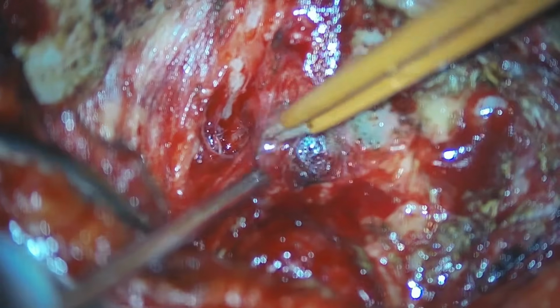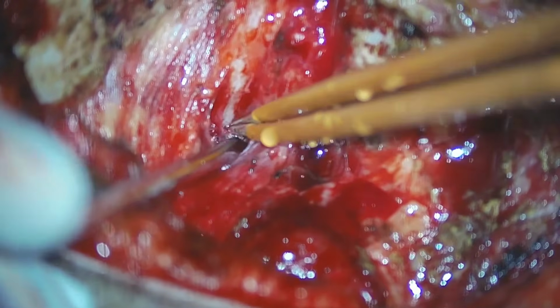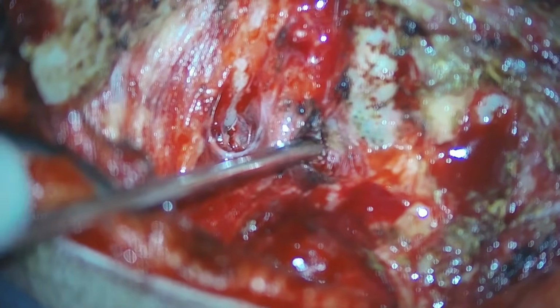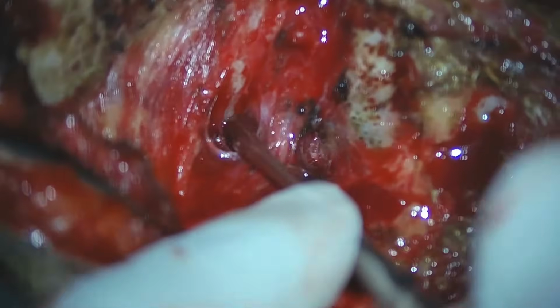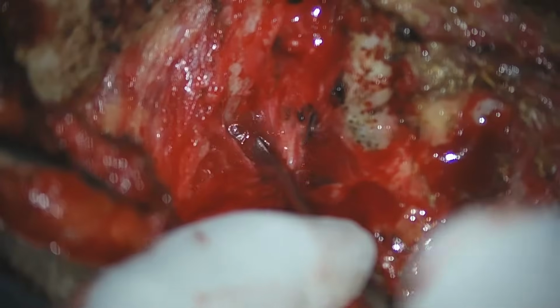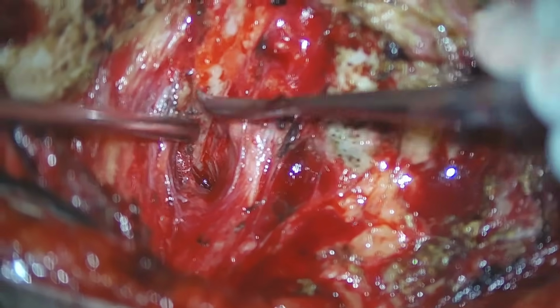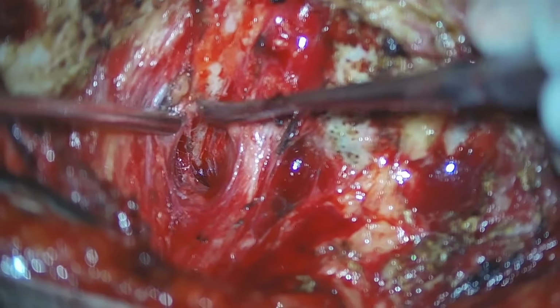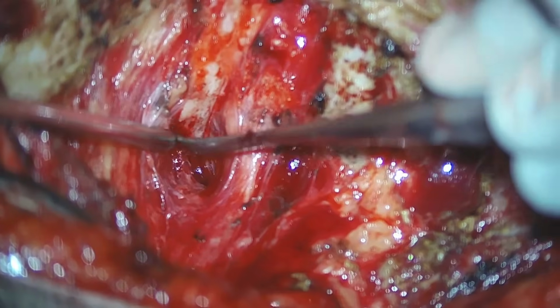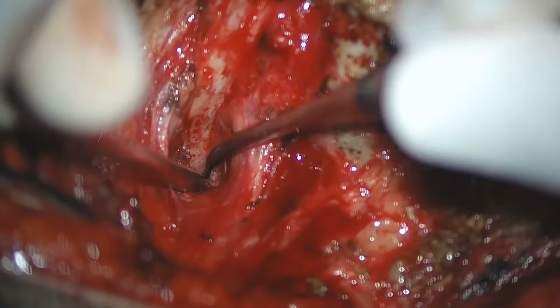Later, the adhesions over the C2 ganglion is removed, and we follow the C2 posterior arch till the C1 C2 junction, C1 C2 articular junction. All these steps are to be done under high illumination and high magnification, as there are vital structures like vertebral artery is very near to the C1 posterior arch, which is crossing over the C1 posterior arch in the vertebral artery groove. We slowly identify the C1 lateral mass by careful, sharp dissection and dissection using the dissector.